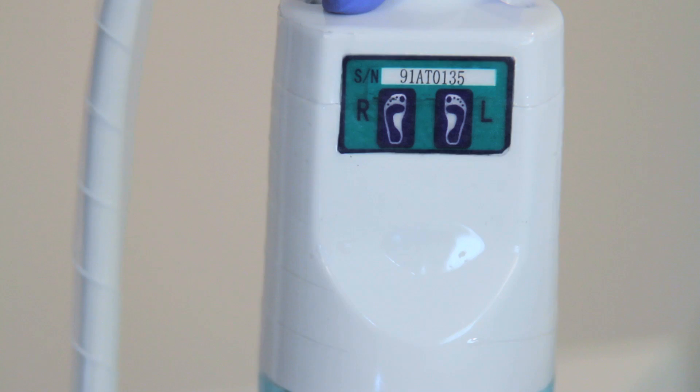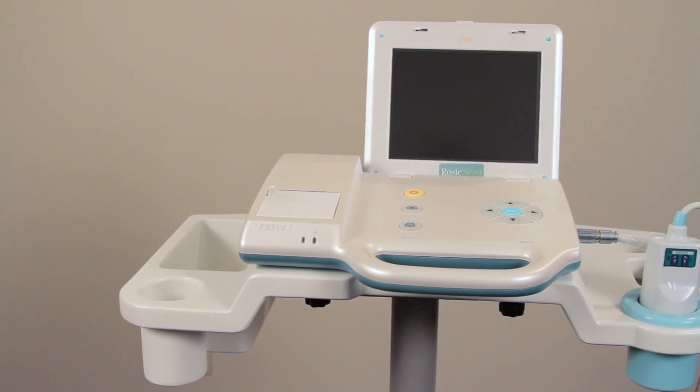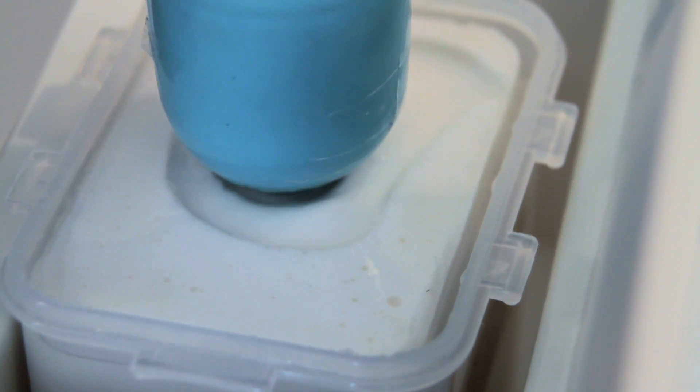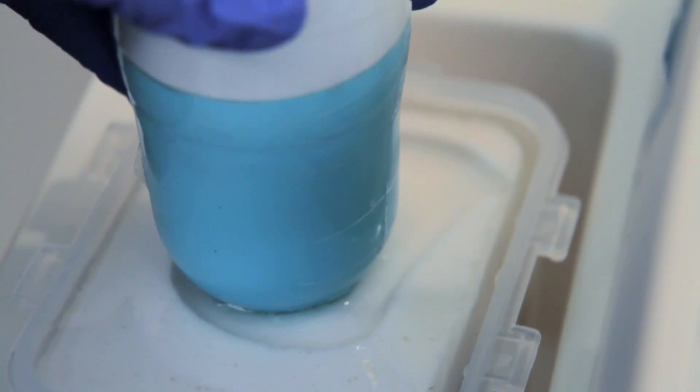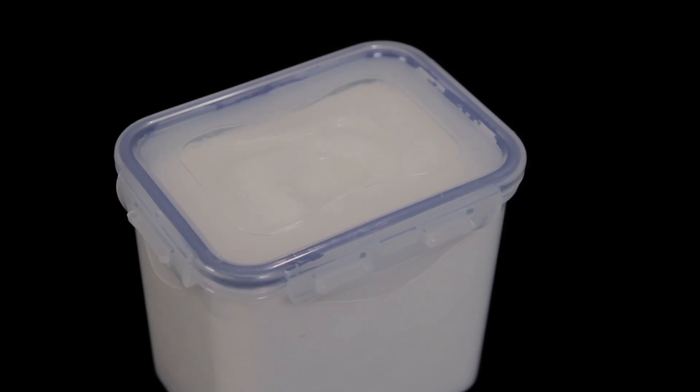RosyScan comes with a 2-year warranty and is supported by Nurse Rosy Products Technical Support Team. It is now time for you to get to know RosyScan. We will be demonstrating how to operate RosyScan with the use of a phantom bladder. You can also purchase a phantom bladder from Nurse Rosy for training purposes at your facility.